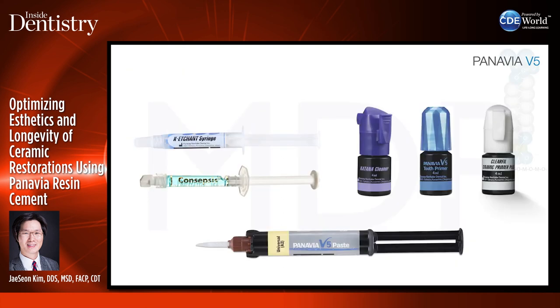These are the materials I need when using Panavia V5 on cementation day: phosphoric acid etch for selectively etching enamel, Consepsis (2% chlorhexidine) to inhibit MMPs and for antibacterial effect, Katana Cleaner to clean the tooth and restoration, tooth primer for V5, ceramic primer on the restoration, and the Panavia V5 paste.